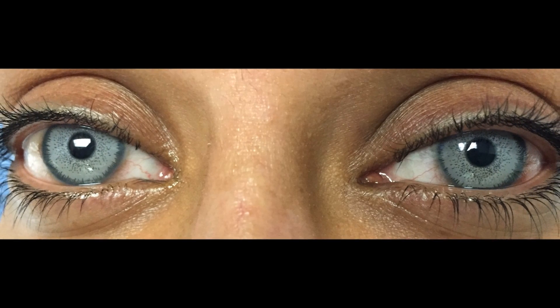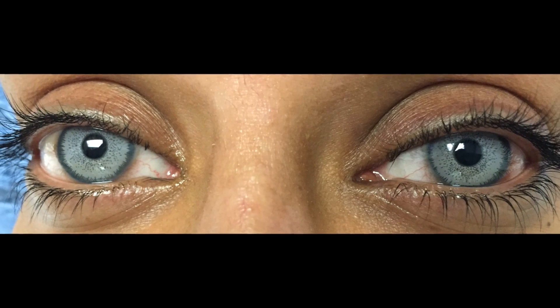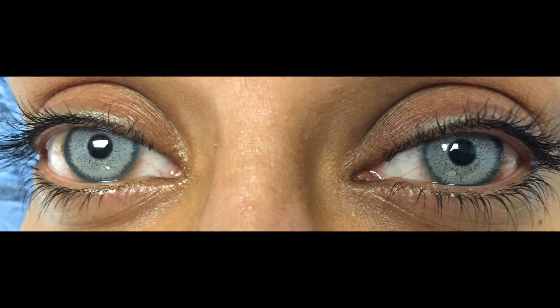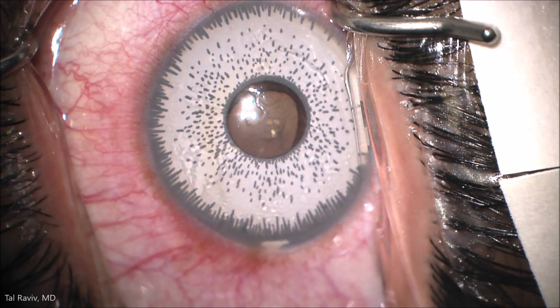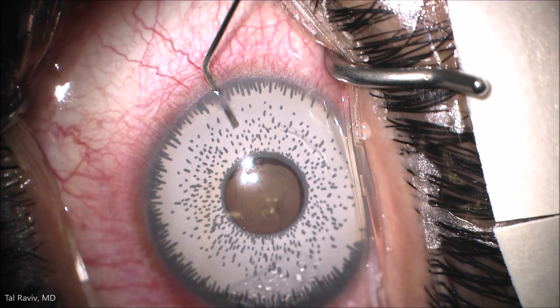This patient presented with redness and decreased vision in the left eye following binocular implantation of the BrightOcular cosmetic iris implant. Here is the view before removal of the implant, which was causing complications.